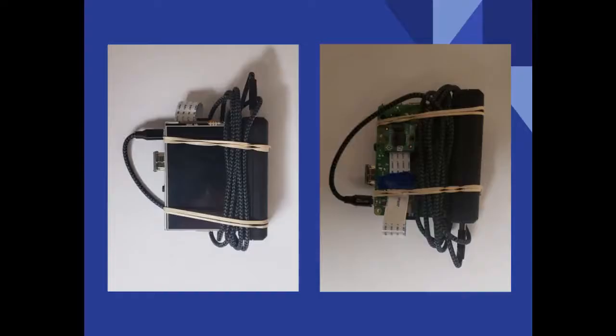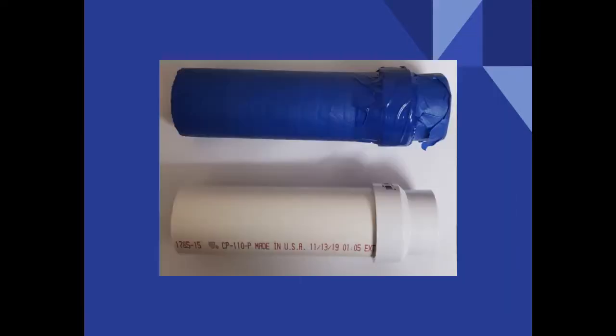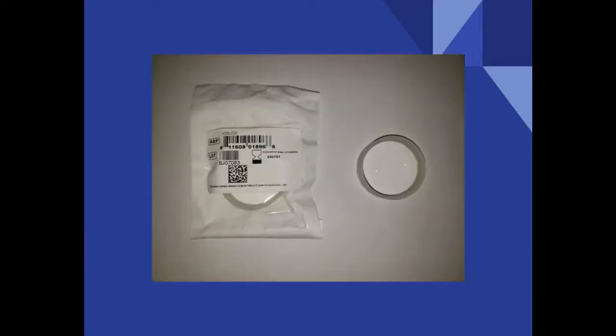And then here we can see the fundus camera. We have the touchscreen display, and then you can see the Raspberry Pi computer and camera. And then this was the PVC used in the lens as well. The inside of this PVC was actually painted black. I was able to get these condensing lenses by contacting a company and asking for samples.